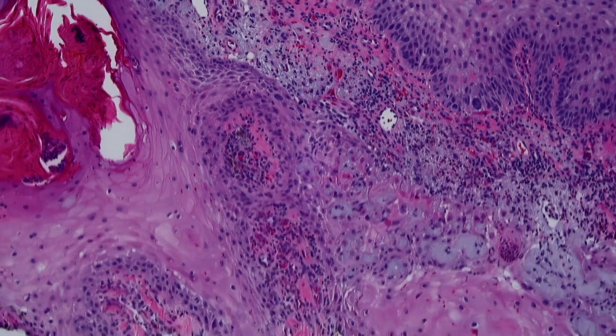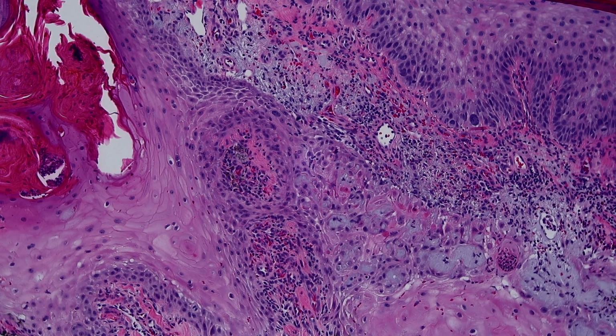I'm pretty concerned about this one though, but if I'm having trouble deciding if I should call it definitively a squame, or maybe the top of a keratoacanthoma if you like, and again, we'll talk about that in another video, but I tend to still usually refer to those as a variant of squamous cell carcinoma, but that is controversial, and we'll address that separately.